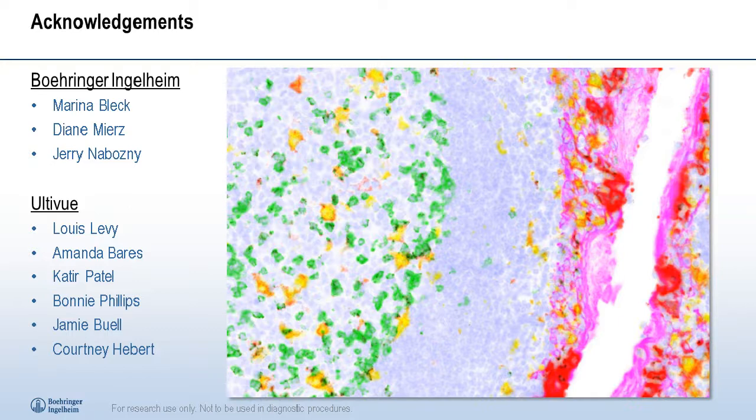Someone asks, can this method detect intranuclear proteins? I think the answer here is also yes. We've only really had experience with the antibodies that have been produced in the existing kits, and there we see those punctate spots with Ki67, which is a nuclear protein. So this is certainly something that we're exploring: how can we look at that intracellular subcompartment analysis with respect to IHC using the kit?